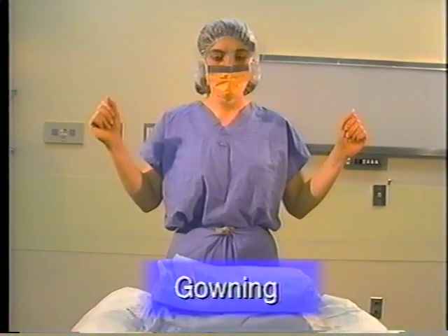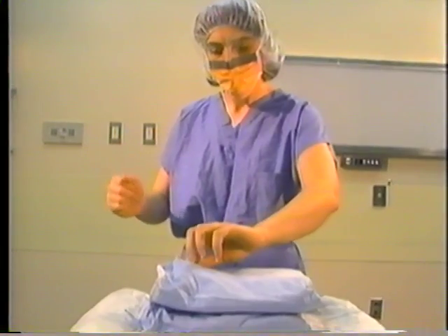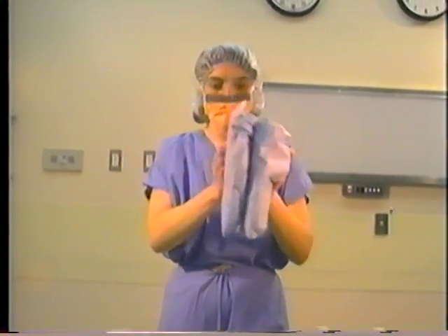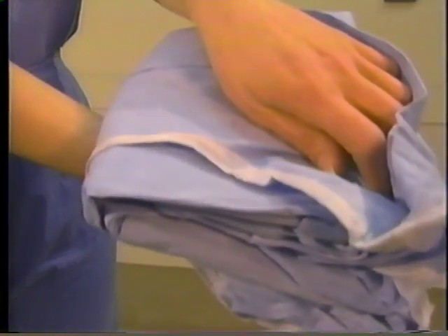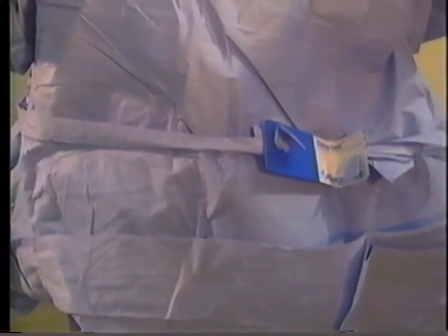To don the gown, lift the folded gown directly upward from the sterile package. Step back from the table. Carefully locate the neckband and hold the inside front of the gown just below the neckband with both hands. Let the gown unfold while keeping the inside of the gown toward the body, without touching the sterile exterior of the gown with bare hands.